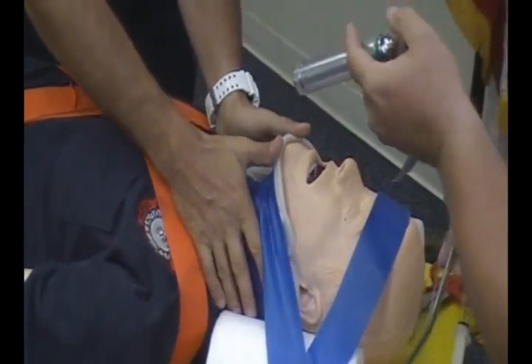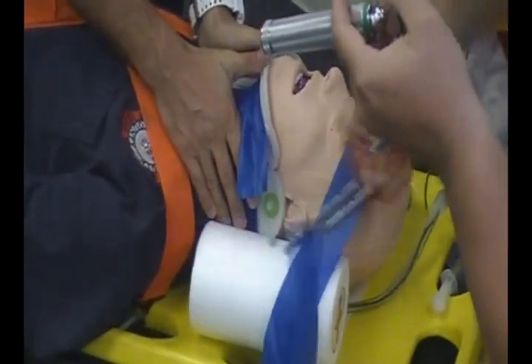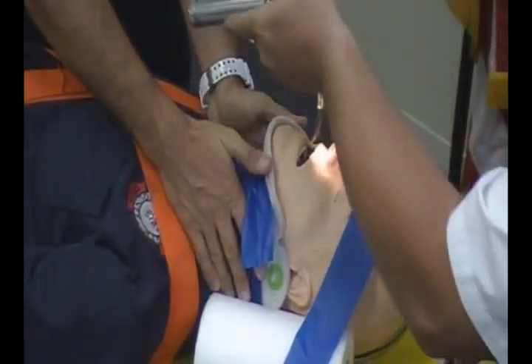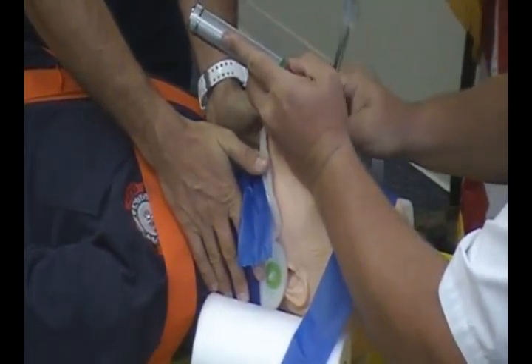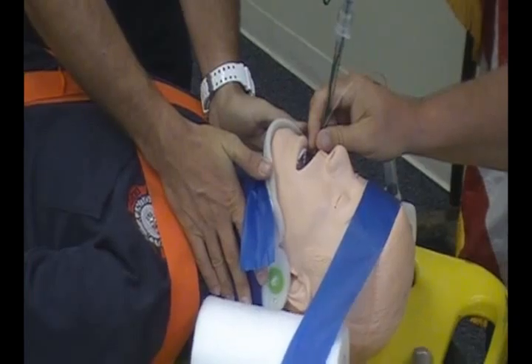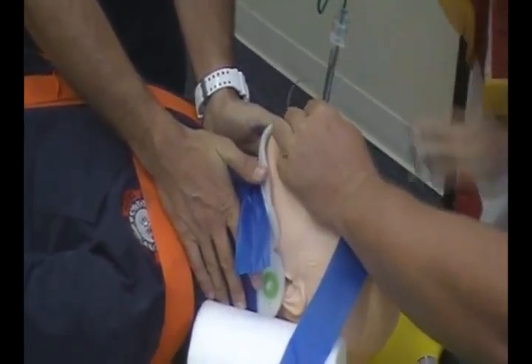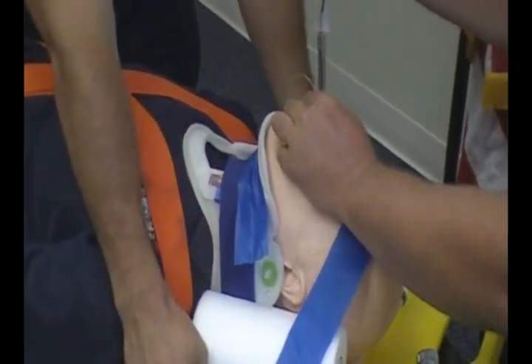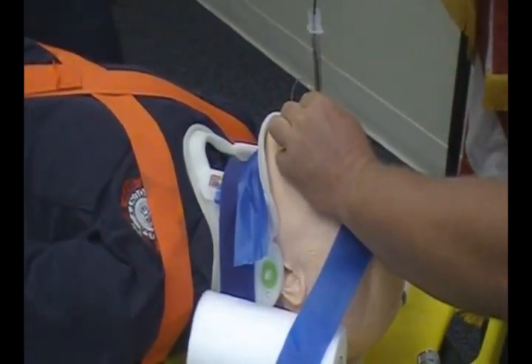At this point, call in a partner to take manual C-spine immobilization. Cut that bottom tape — this allows for a little bit more movement. He can then pass the tube, confirm his airway, and then re-tape the lower section. This leads to a successful intubation.